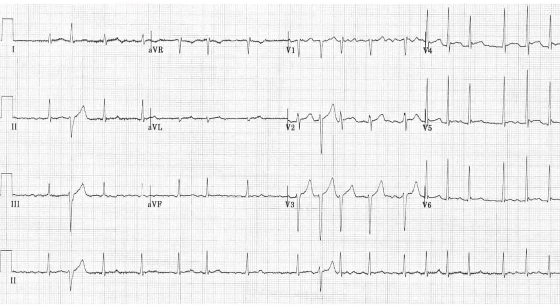Well, that's where the case study comes in. We've got this 81-year-old man, and he comes in with some pretty general symptoms, things like swelling in his legs, fatigue, just not feeling his best. So pretty general stuff. I imagine those could be signs of a lot of different things, not just a heart problem. Exactly. But then when they did an EKG, that's when things started pointing towards Ashman phenomenon. So the EKG is really the key here, it sounds like. What was it about his EKG that made them think, hold on, this could be Ashman's?